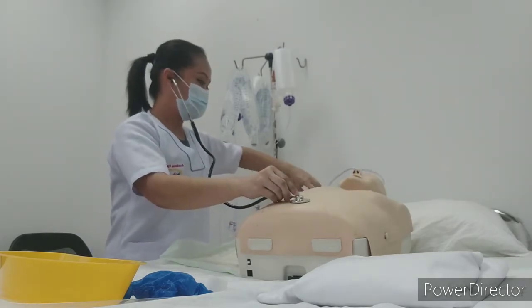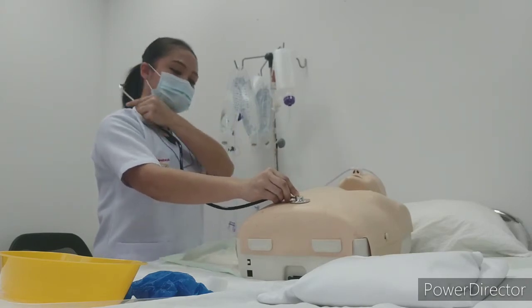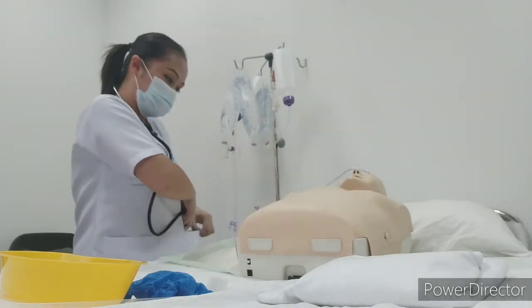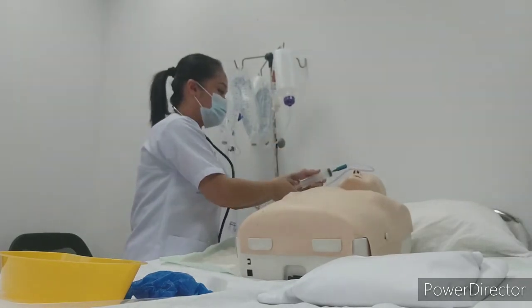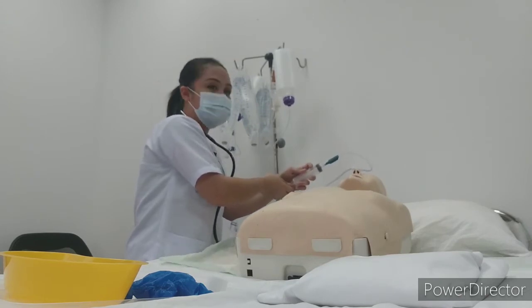And then we need to push it hard. If you hear a bubbling sound, it means you're in. Okay? So the second one, you will put the diaphragm here in your pocket. The second test is aspirate 10. You will see a yellowish or whitish gastric fluid.